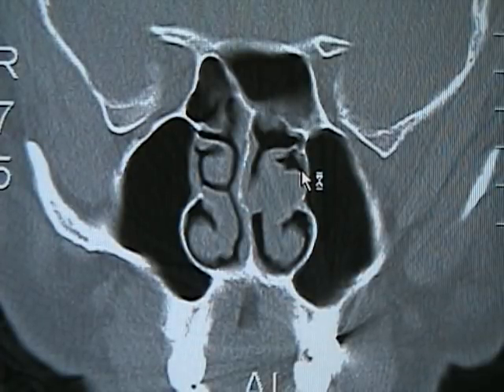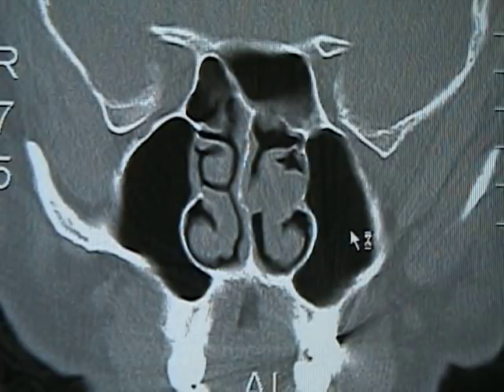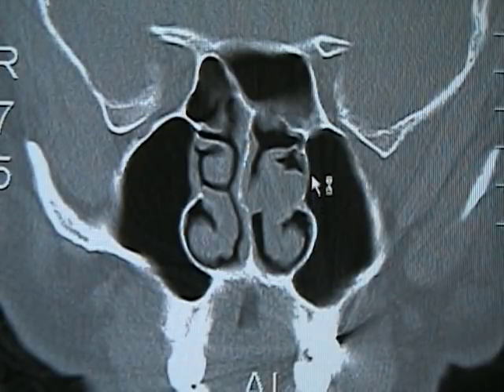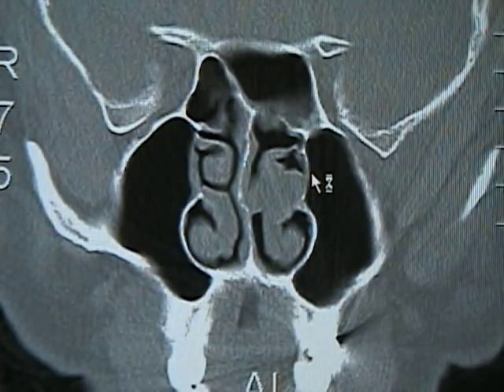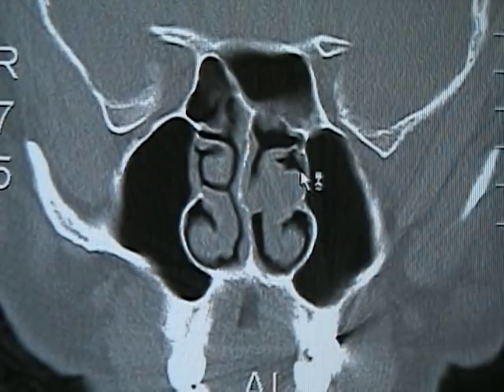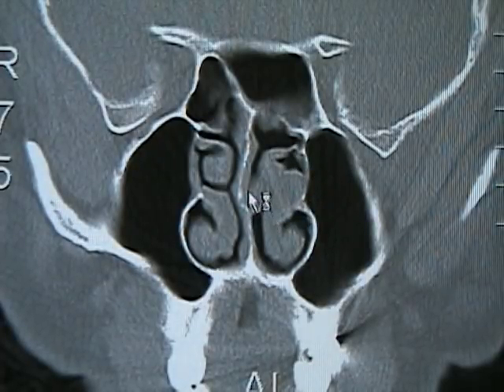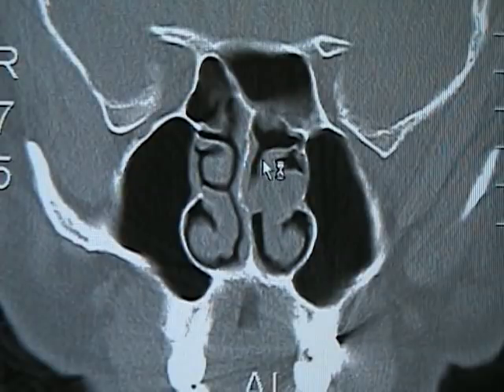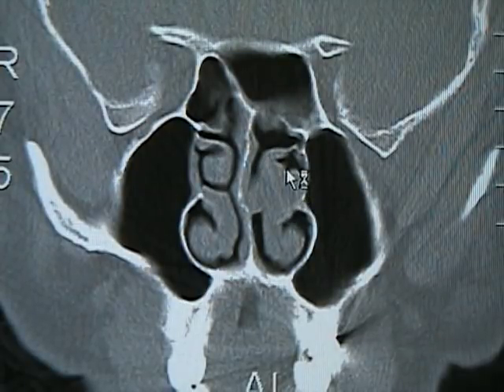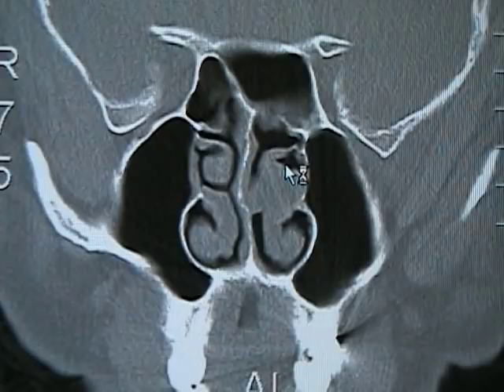In other words it didn't originate within the maxillary sinus and extend into the nasal cavity through either the ostium or an accessory ostium. Rather, what we were dealing with was an isolated stalked large choanal polyp originating either from the left middle turbinate or from the left ethmoidal bulla.